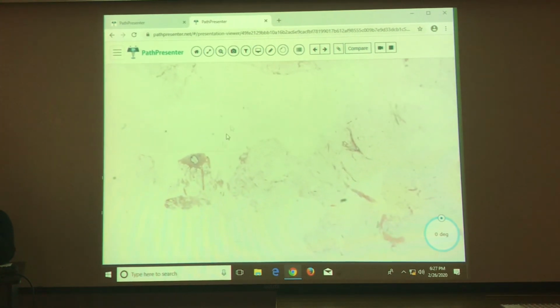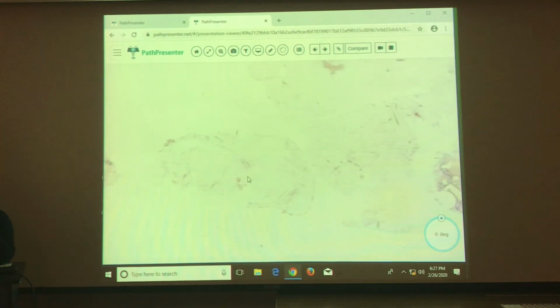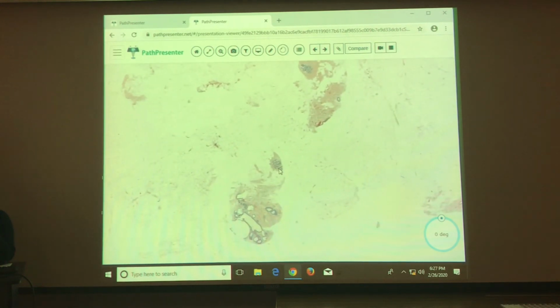Excellent. There, see, you guys don't even need me up here. You know all this stuff. Just where it is? Here? No, it looks very innocent.